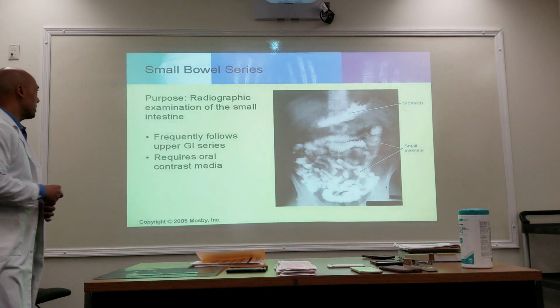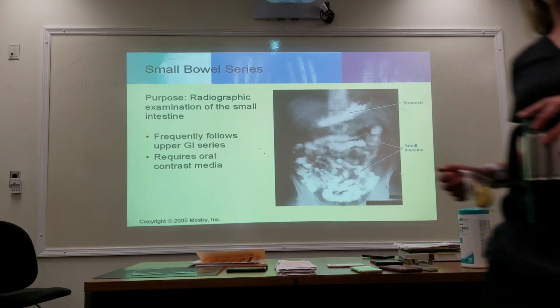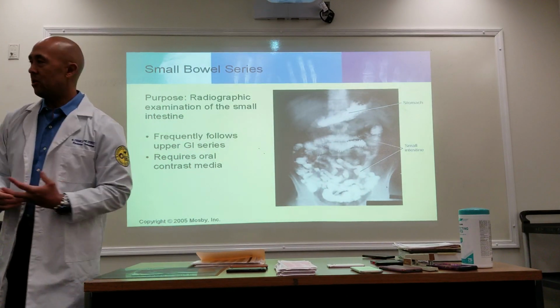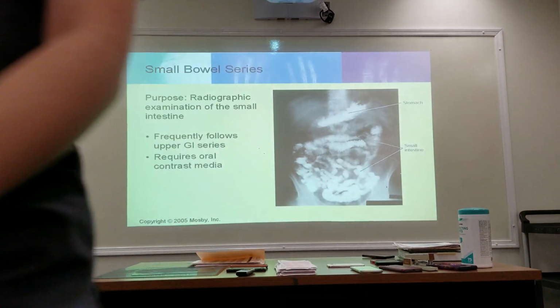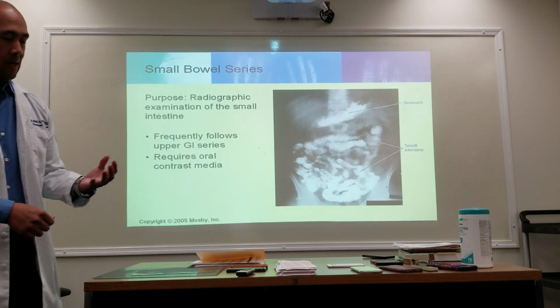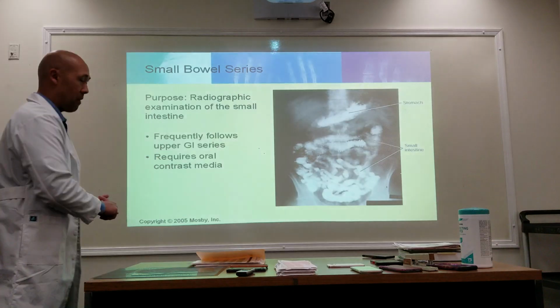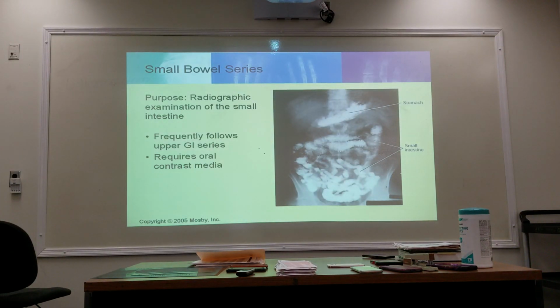Alright, so the small bowel series. The purpose of the small bowel series is to study the small intestine. As I had said last week, it generally follows the upper GI series. There will be some times where the doctor will order a combination of esophagram, upper GI, and also a small bowel series that all kind of is done together. It does require oral contrast media.